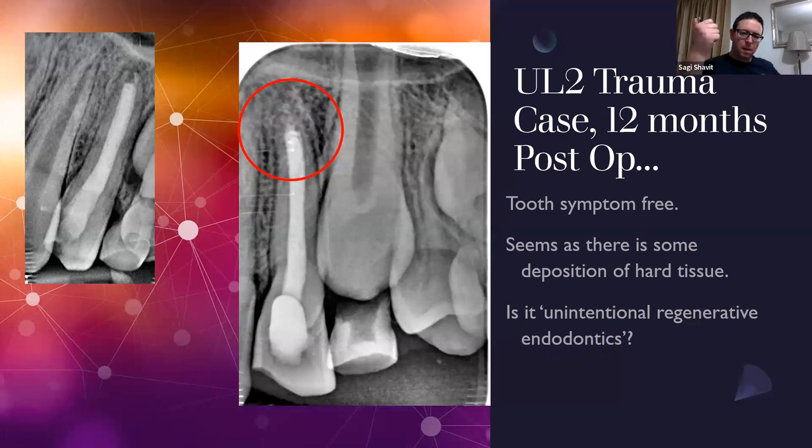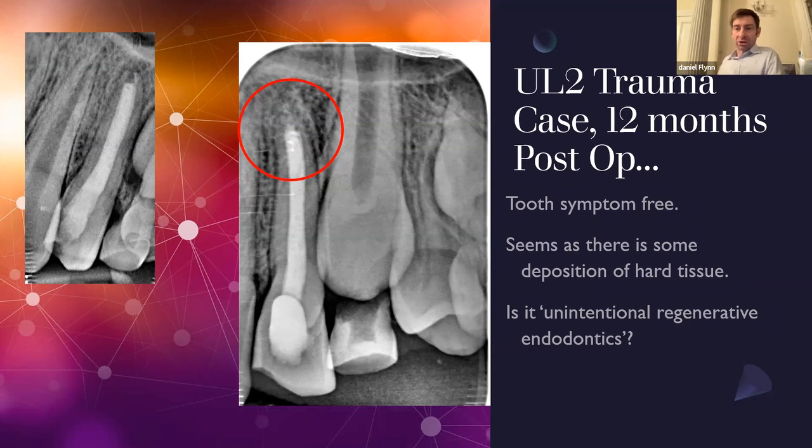The washout of bioceramic putty will be much less than bioceramic sealer, because bioceramic sealer is more flowable than the putty, less washout resistance. But if you look at, Daniel, you did a nice video on an apicectomy, and you can see Daniel squirts water on top of his bioceramic plugs, and it doesn't wash out. So if it resists that squirt of water, that doesn't happen in the body, because that's under high pressure. Even then, you can drill it within a couple of minutes.